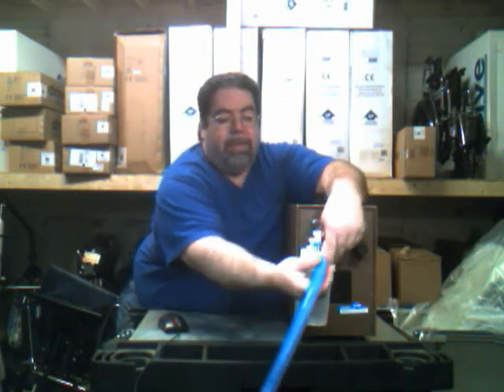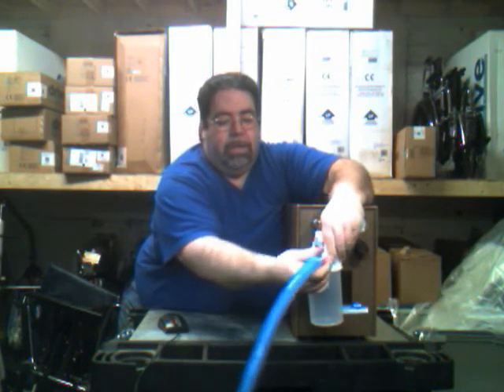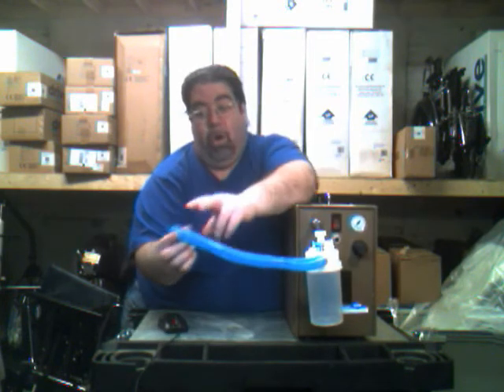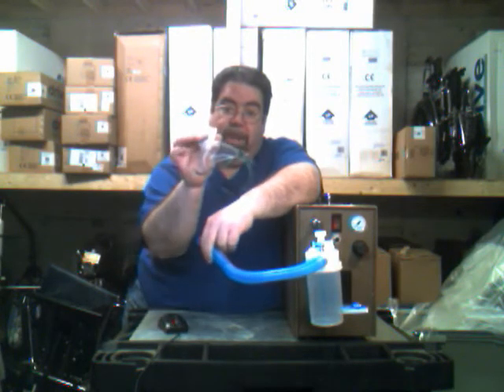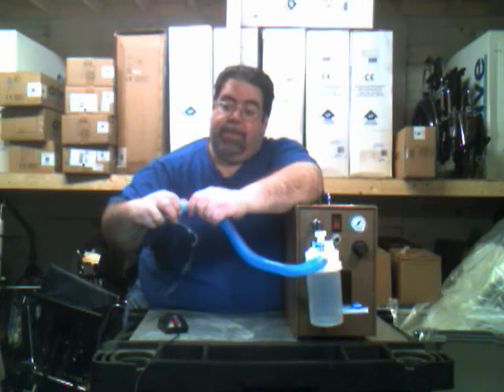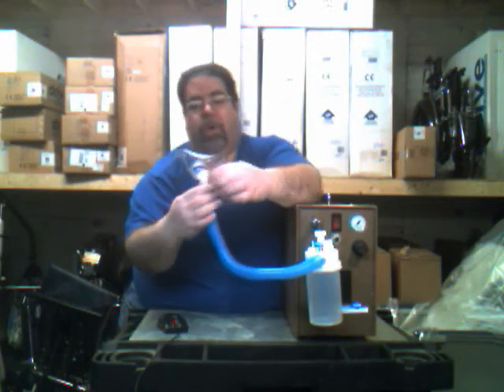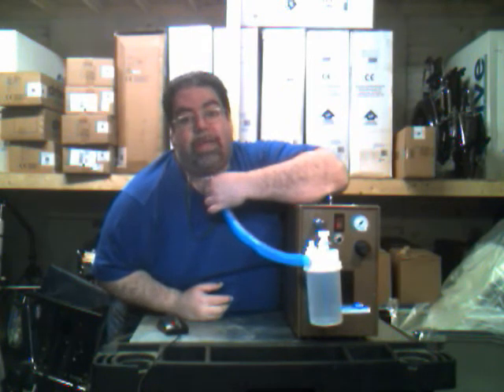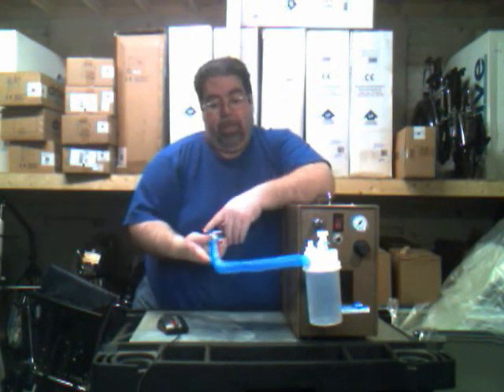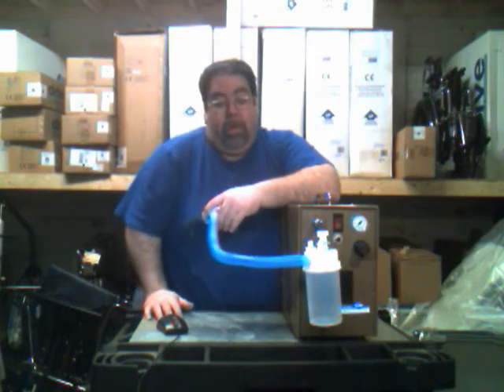The corrugated tubing slides right into the nebulizer — it's a little snug. The other end, which will be longer in practice because it has to reach your patient, goes to a trach mask. There's only one place to connect it, and that slides right in as well — also a little snug — so the mist goes right through. This would go around your patient's head and right to their stoma, or their trach, to provide adequate humidification and avoid complications from lack of humidity, such as colds and similar issues.